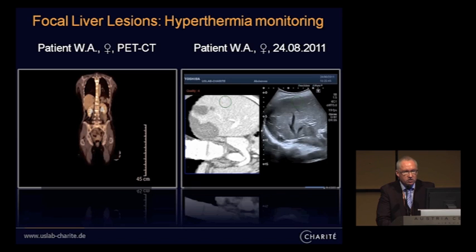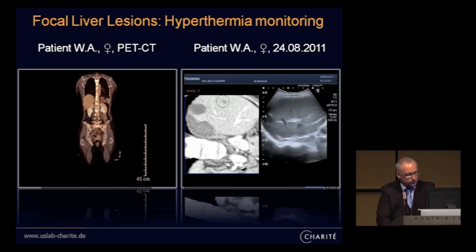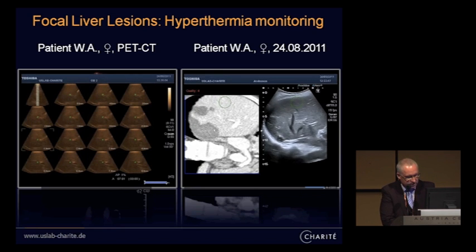This is a 4D contrast evaluation, especially of the hilum of the liver, to see what happens with the portal venous system as well as the arteria hepatica. As I told you before, this is a problem of this therapeutic option, and we see very beautifully here the central vessels. We see a complete filling of the liver in each scan plane, very nicely reconstructed.